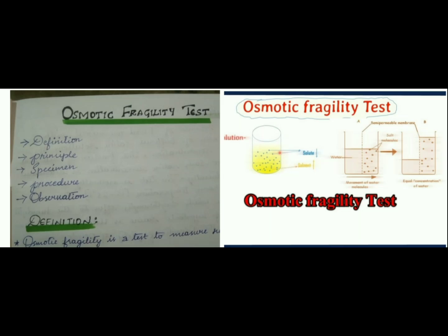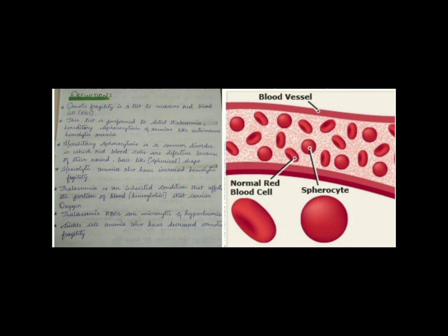Today we are going to discuss the osmotic fragility test. The topics we are going to discuss are the definition of osmotic fragility, principle, specimen, procedure and observation. Let's know about osmotic fragility.